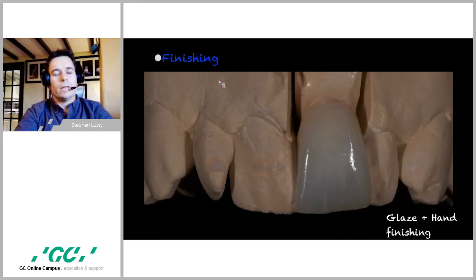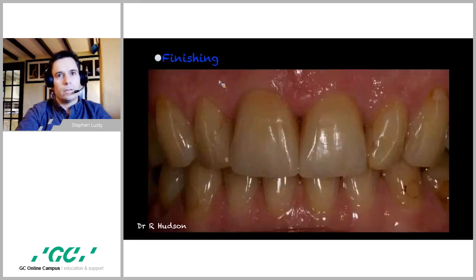And it's really important that we say trying, because we need to get this philosophy right with our clients: it's never a fit appointment, it's always a trying appointment. That way the patient becomes willing to work with us, and if we need to make alterations, they are more open to allowing us to make these alterations. Quite often when I used to say fit appointment to clients, the patient would go in there expecting the client to fit it, and they would accept something that was not necessarily 100%. So they weren't getting the best out of it purely because they were in a rush, and we weren't getting the job satisfaction out of it. So it's far better to tell your clients, and get them to tell their patients, that that appointment is a trying appointment. That way it's only a bonus if they get it fitted.